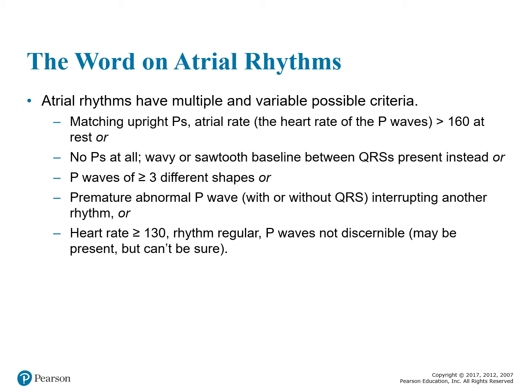Regular P waves may not be distinguishable; you can't be sure because you don't know if it's a P wave or not. Always remember that atrial rhythms can have a positive or a negative QRS depending on the lead in which the patient is being monitored.